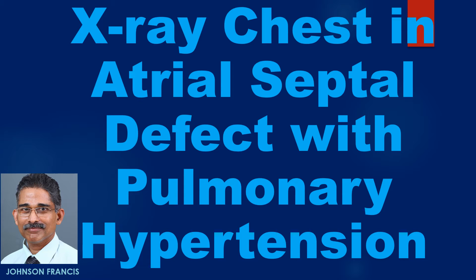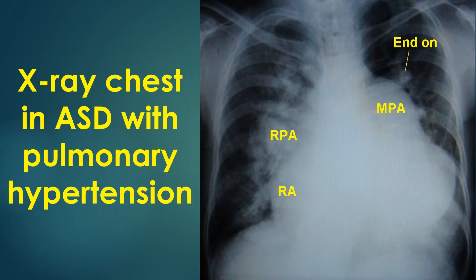X-ray chest PA view in atrial septal defect with pulmonary hypertension. The main pulmonary artery is grossly dilated. The right pulmonary artery is also quite enlarged. Right atrial enlargement is seen as shift of cardiac border to the right side of the spine. Pulmonary vascularity is increased and prominent endon vessels are also seen.